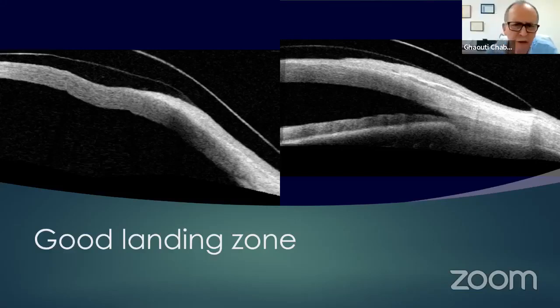Personally, I found that one of the difficult cases is pellucid marginal degeneration, because it's not so obvious to get the clearance at the bottom of the edge at 6 o'clock. You are using some new technologies, but we are using most of the time scleral lenses which are not manufactured so precisely. So, what's your advice?